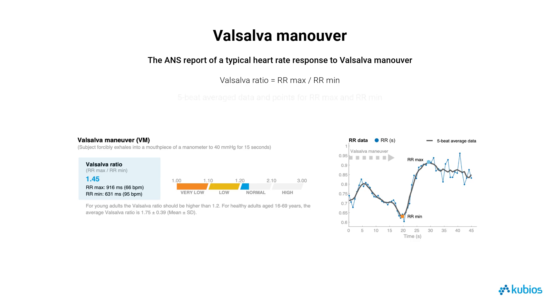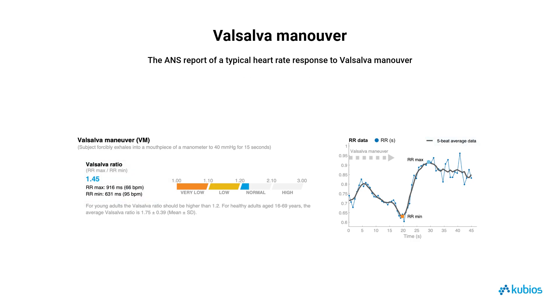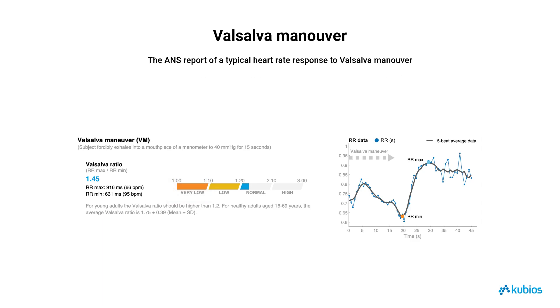To improve precision, the ratio is computed using 5-beat average values for both the longest and shortest intervals. In QBOs HRV software, the Valsalva ratio is presented using a 4-zone model based on reference values for healthy adults. The zones are very low, low, normal, and high. A Valsalva ratio within the very low zone is considered abnormally low for healthy adults across all age groups. Younger adults, specifically those under 40 years of age, are expected to exhibit Valsalva ratios within the normal or high zones.